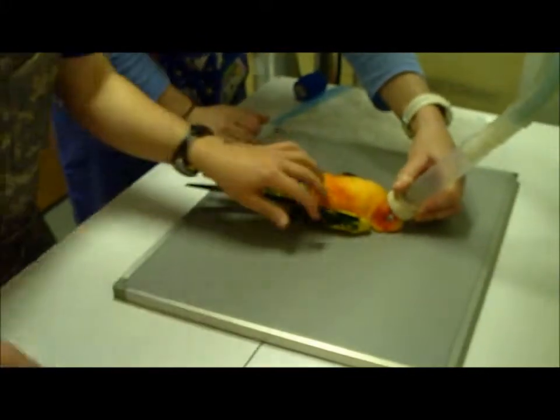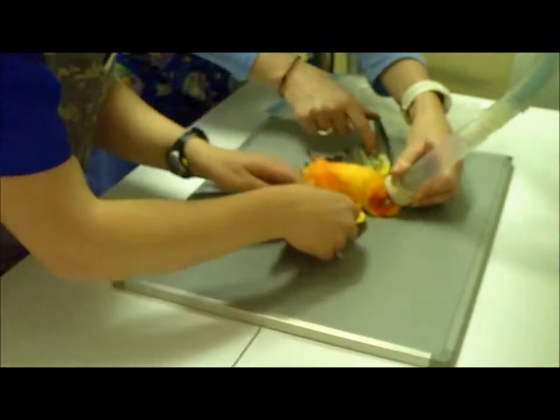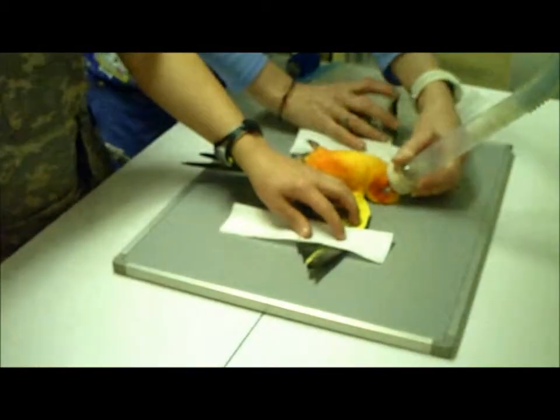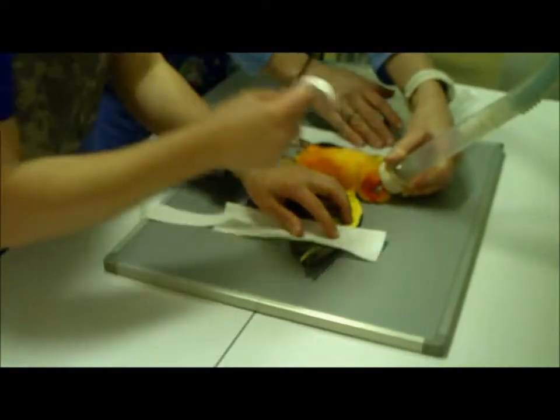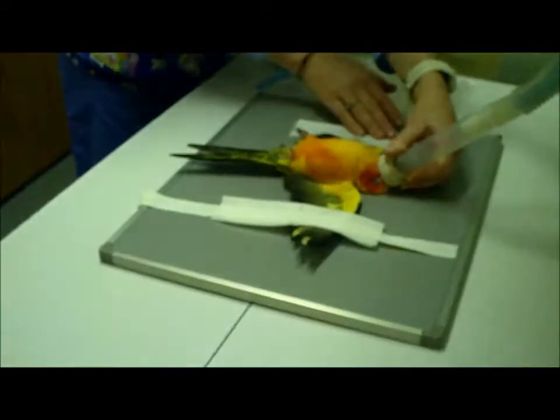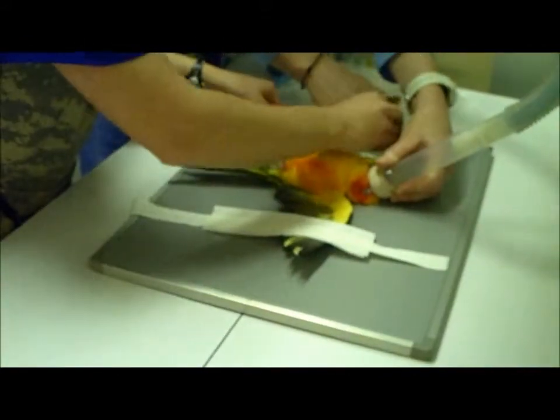Before we get started, I will let you know that you can barely see it, but I am wearing a lead apron, a thyroid shield, a dosimeter badge, and will be wearing gloves when needed. That is me closest to the film in the camo lead apron, which you all have seen before.